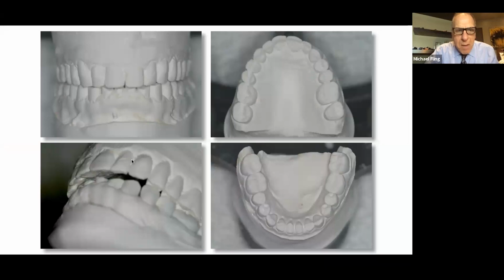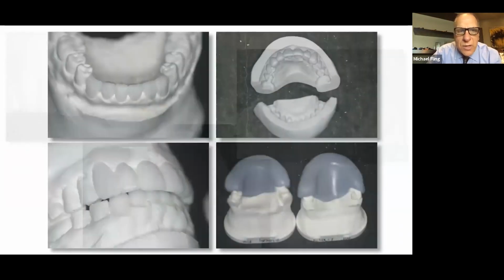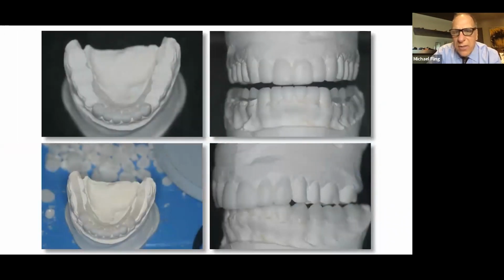Here's our diagnostic models after the ortho. From that, we're going to do our diagnostic wax up. Here's our diagnostic wax up. We do the upper anterior first. We do the lower anterior next. We then do the lower posterior and then the upper posterior.